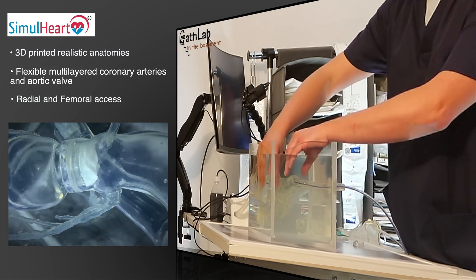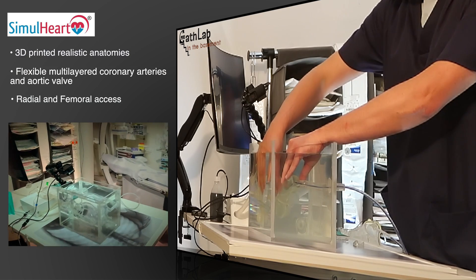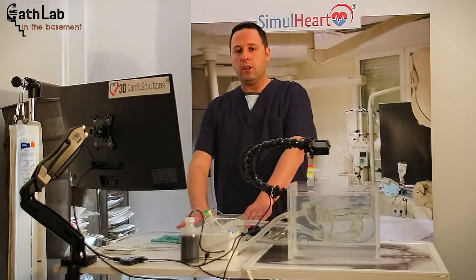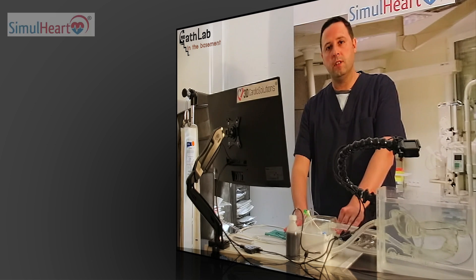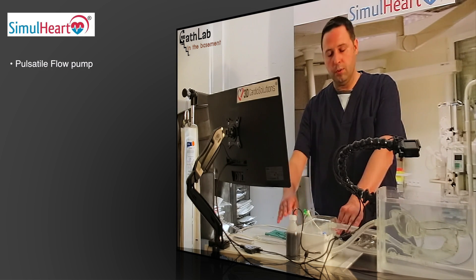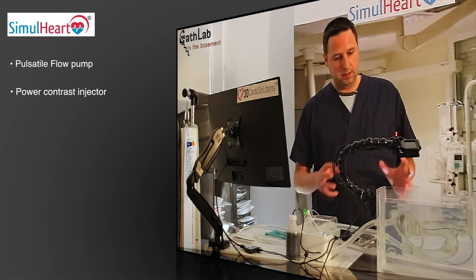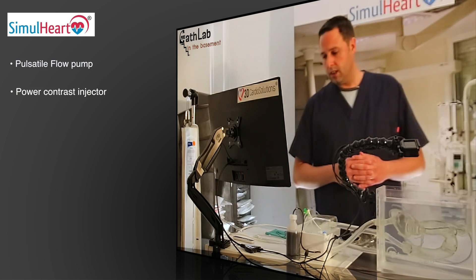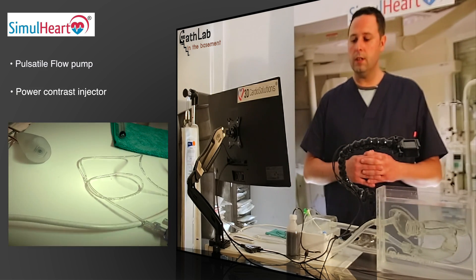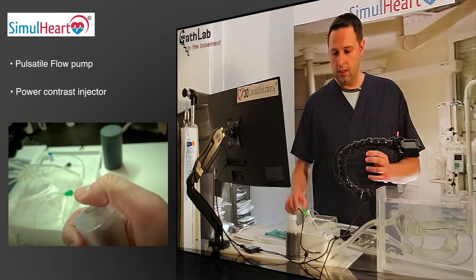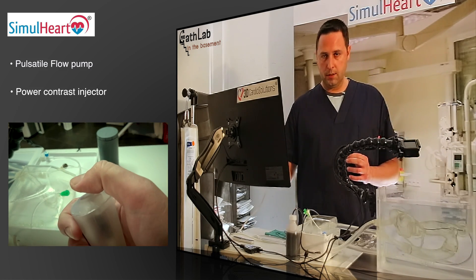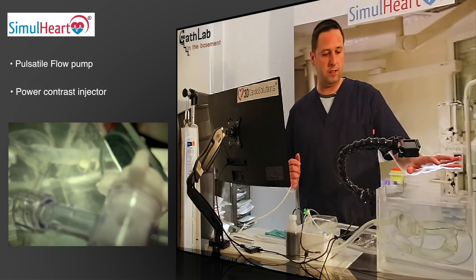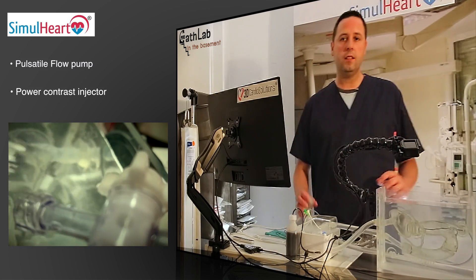This is the left coronary artery and this is the right coronary artery. Inside this box we have the pulsatile pump that is making pulsatile flow throughout the system, and we also have the power injector that, when we press this button, is going to take the dye out of this bottle and send it into the coronary arteries.